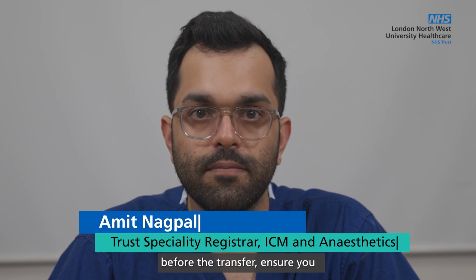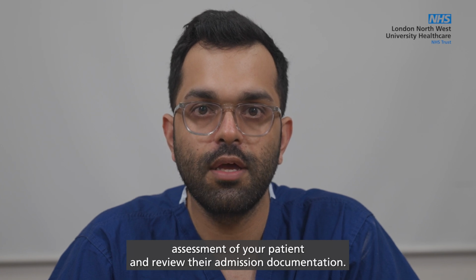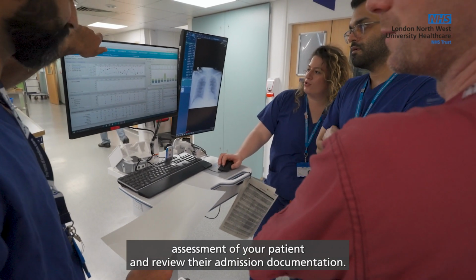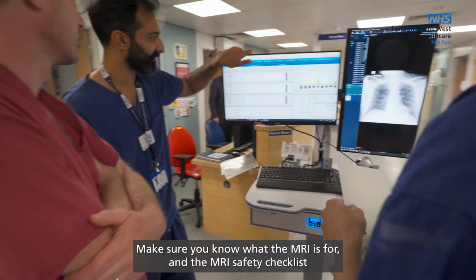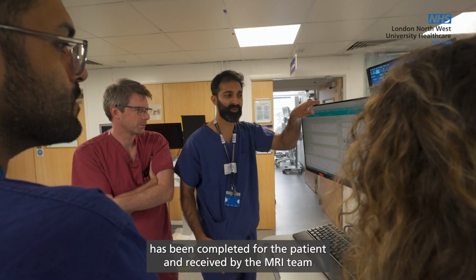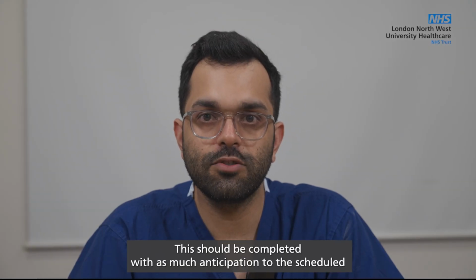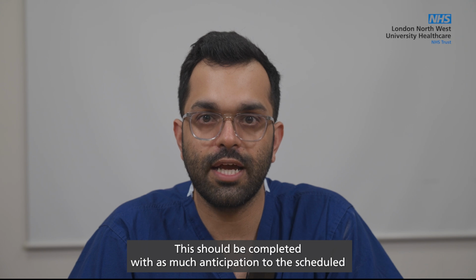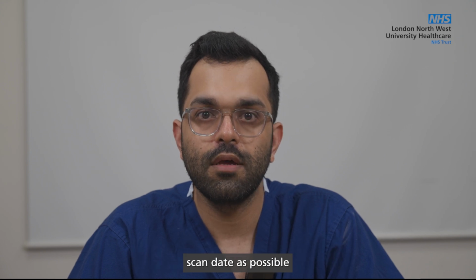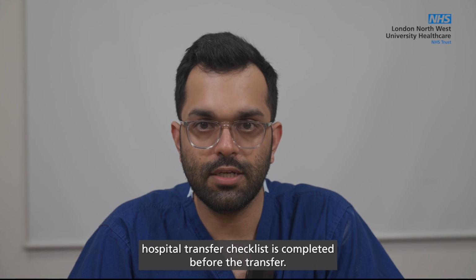Before the transfer, ensure you complete an A to E assessment of your patient and review their admission documentation. Make sure you know what the MRI is for and the MRI safety checklist has been completed for the patient and received by the MRI team. This should be completed with as much anticipation to the scheduled scan date as possible. Additionally, a standard intra-hospital transfer checklist is completed before the transfer.